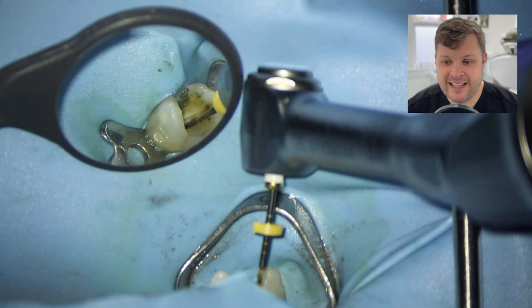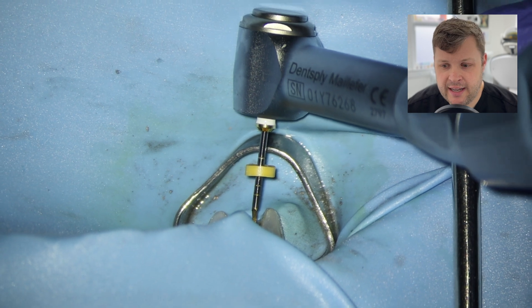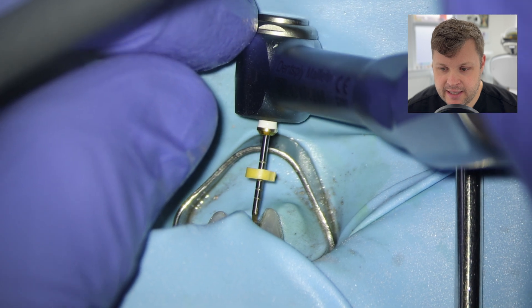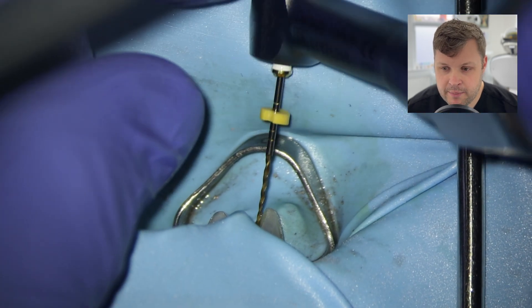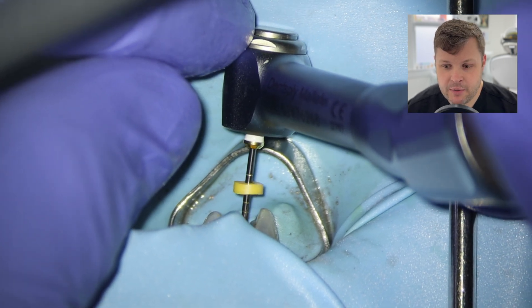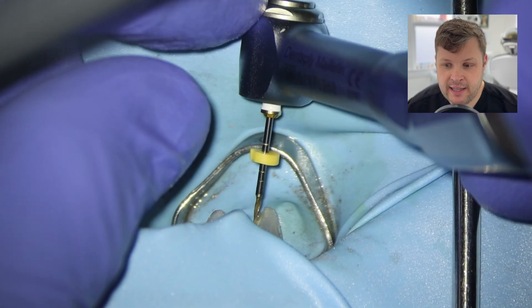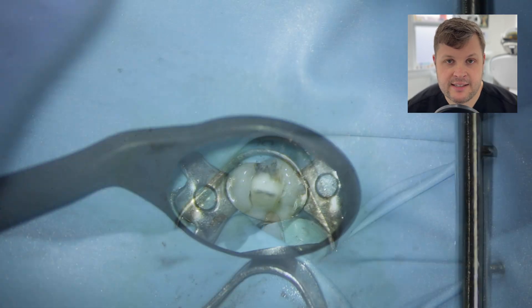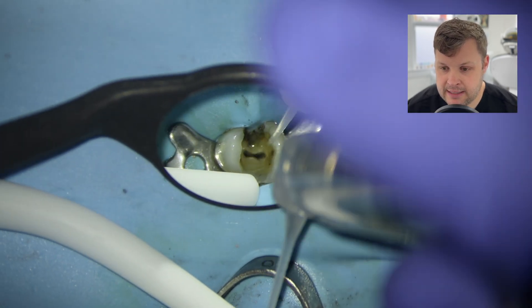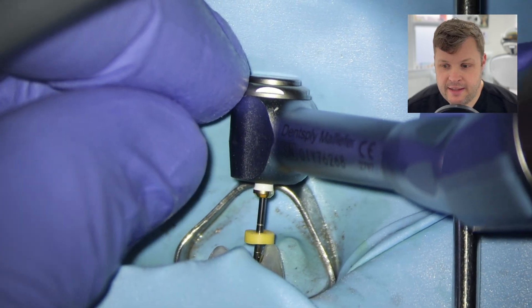The size 15 HyFlex glide path files are getting stuck at a certain level and not advancing all the way to working length. So I put the rotary file into T-mode, wiggle it around a little bit, and it starts to advance. Once I feel it's reached a certain level, I press another button for a rotary motion to shape out the ledge or abnormality in the root canal. Lots and lots of irrigant throughout — I'm not happy until it's gone to length nicely.